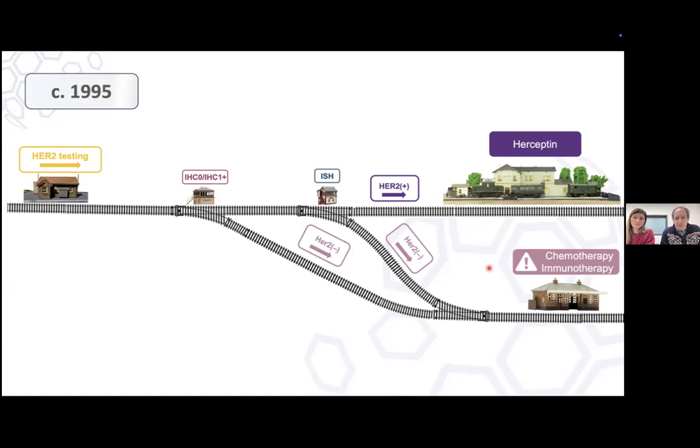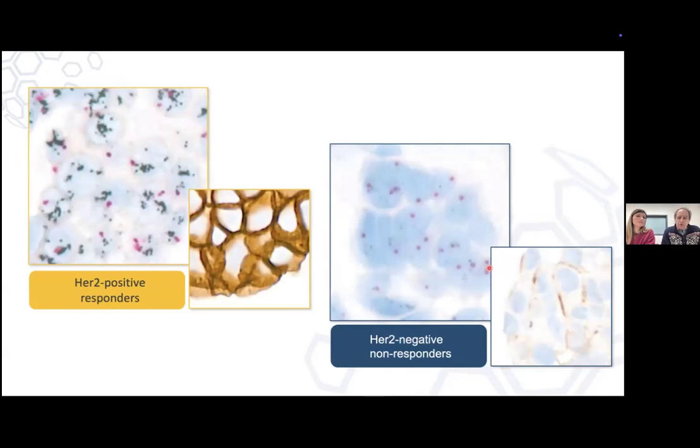That was great. And this is because the real task was to identify those tumors that had oncogenic mutations in HER2. These were early changes in breast cancer cells that were pervasive in most of the tumors, so every cell carried this mutation, and the mutations were mostly gene amplification. To be honest with you, we weren't very sophisticated at the time. We called it gene amplification. These were possibly amplification of a portion of the genes or mutated genes that were then amplified, but it doesn't matter. There were a lot of these genes, exemplified here by clusters of silver dots inside the cell.